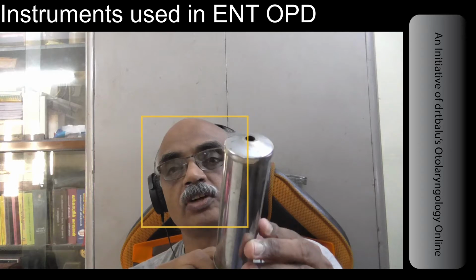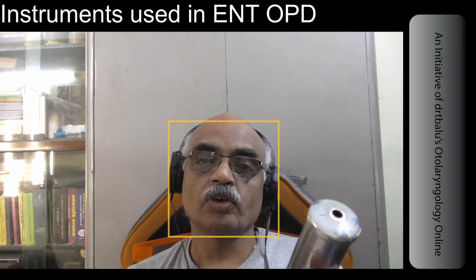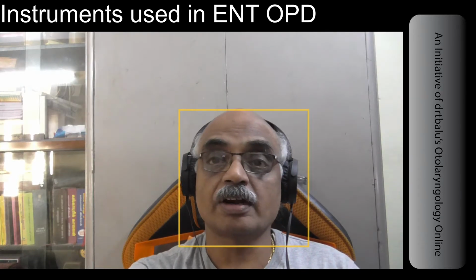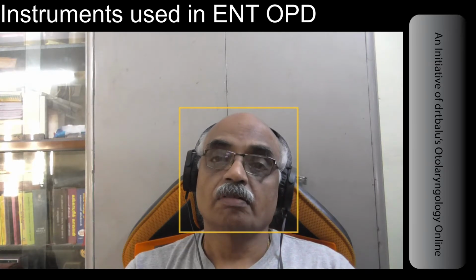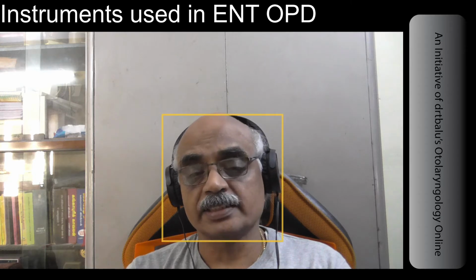You should gently squeeze the piston like this. You should hold it in your dominant hand and squeeze the piston like this. The water will gently flow, hit the roof of the external auditory canal, then flow touching the eardrum, and then flow along the posterior wall and the floor of the canal into the kidney tray held underneath the ear, thereby flushing out the wax or foreign bodies. Non-hygroscopic foreign bodies, if present in the ear, can also be removed by syringing. Syringing is actually a versatile OP instrument, and it really helps us to do away with the foreign body or wax inside the ear cavity.